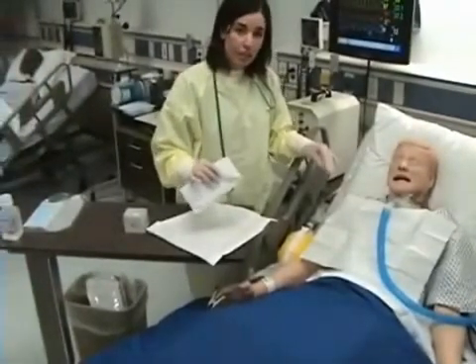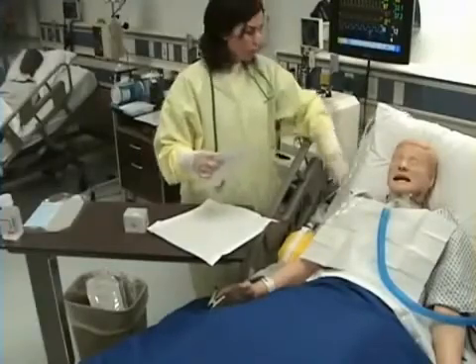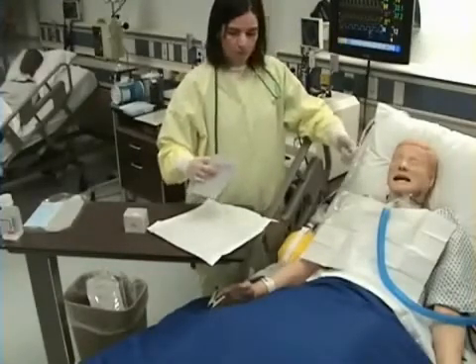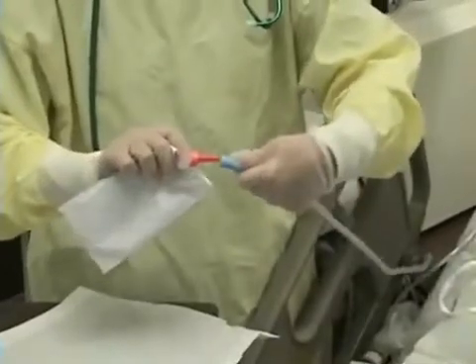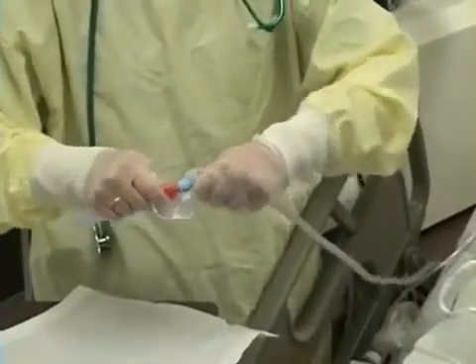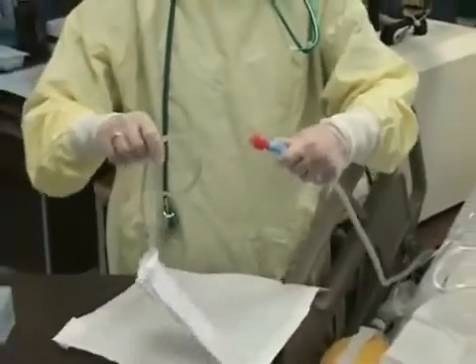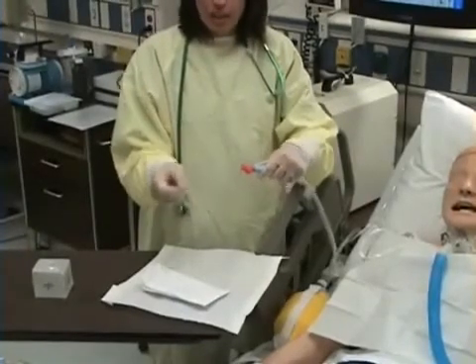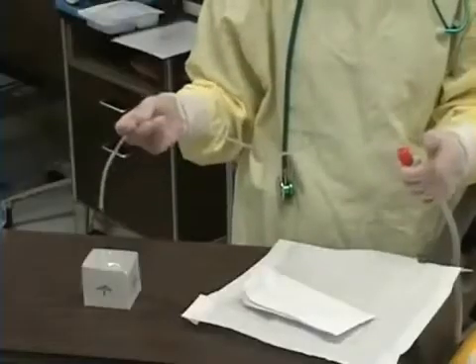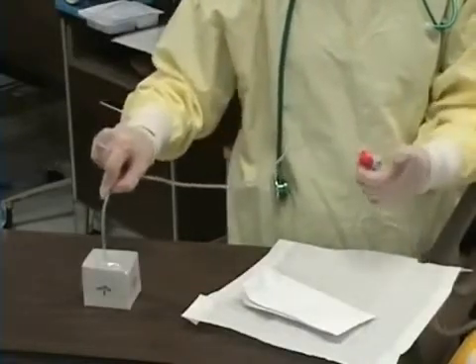Now I will attach my suction catheter to my suction. I can check and make sure that the suction is working. Now what I'm going to do is attach the end of my suction catheter to my suction tubing at the connections, and take the wrapper off my suction catheter. I'm very careful not to let my catheter fall and become contaminated. I will test that my suction is working by putting the tip of my suction catheter in my normal saline.